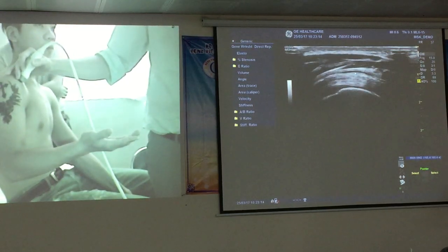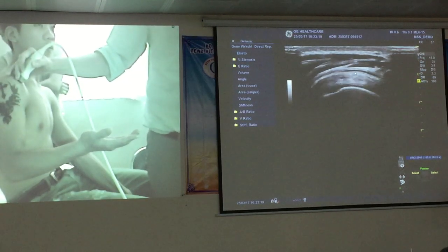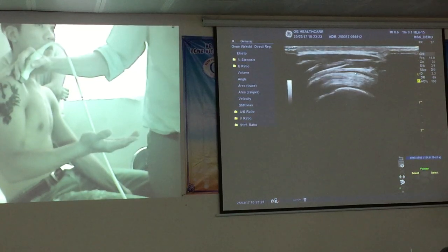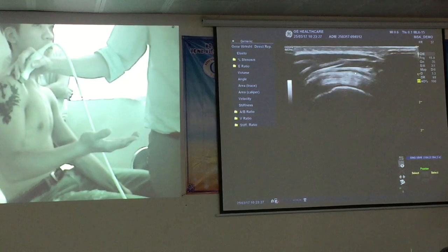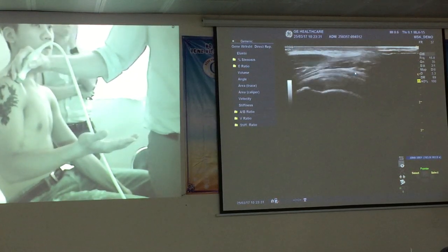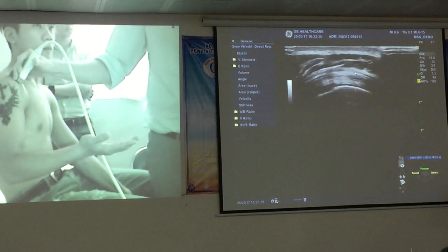However, if this patient, when they brought their arm up, they said, yes, that is reproducing my pain, that would be significant. So you need to correlate what you're seeing on the screen to the clinical presentation. Ví dụ cho dù là mình có thấy một ít dịch ở trong cái bao bọc dịch này, nhưng mà khi yêu cầu bệnh nhân làm vận động mà bệnh nhân nói rằng là tôi có đau thì đây là cái dịch, cái lượng dịch này là có bệnh lý chứ không phải là sinh lý nữa.